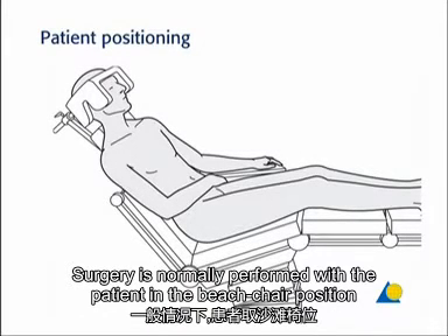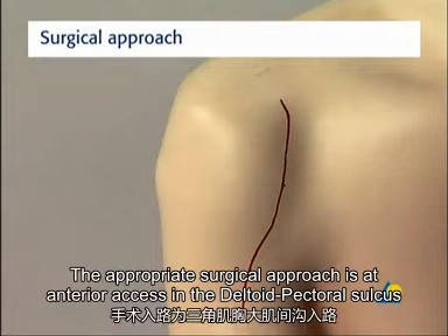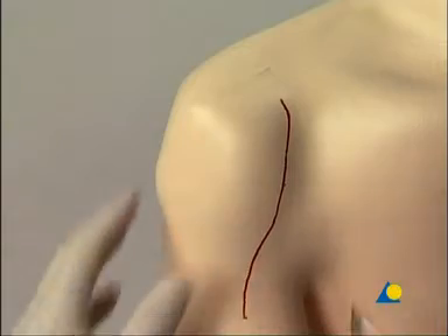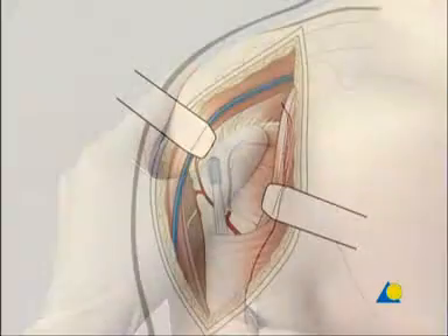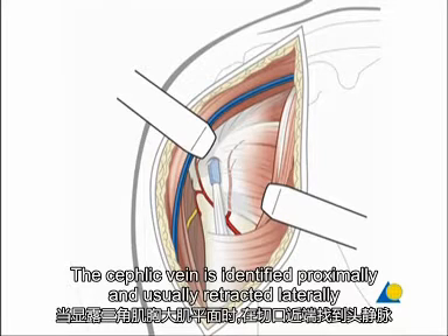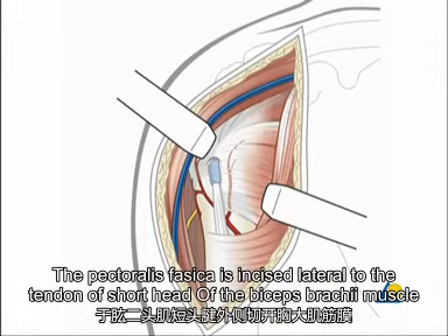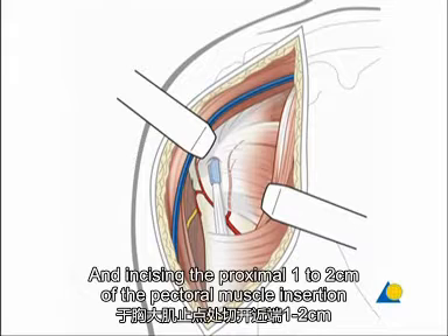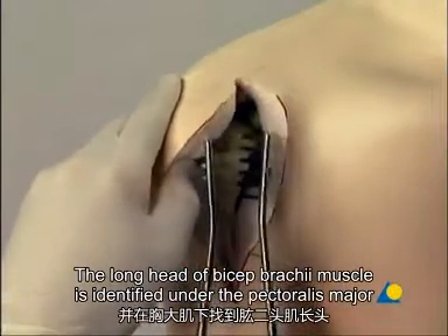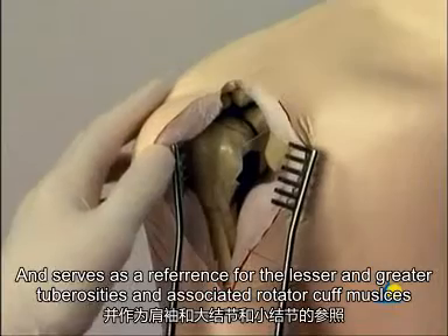Surgery is normally performed with the patient in the beach chair position. The appropriate surgical approach is an anterior axis in the delto-pectoral sulcus. The incision starts at the coracoid process and extends to the humerus at the level of the deltoid tuberosity. The cephalic vein is identified proximally and usually retracted laterally while exposing the delto-pectoral plane. The pectoralis fascia is incised lateral to the tendon of the short head of the biceps brachii muscle, maintaining the coracoacromial ligament proximally and incising the proximal 1 to 2 cm of the pectoralis major muscle insertion. The long head of the biceps brachii muscle is identified under the pectoralis major and serves as a reference for the lesser and greater tuberosities and their associated rotator cuff muscles.